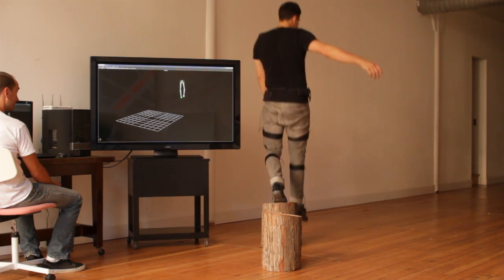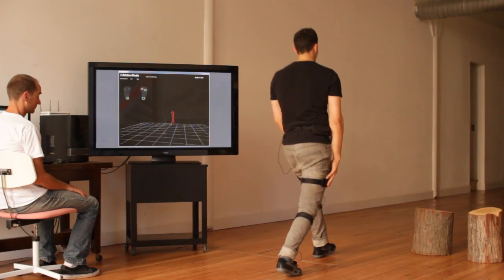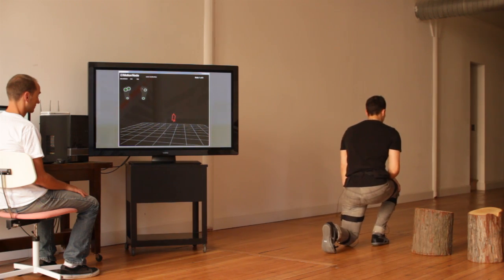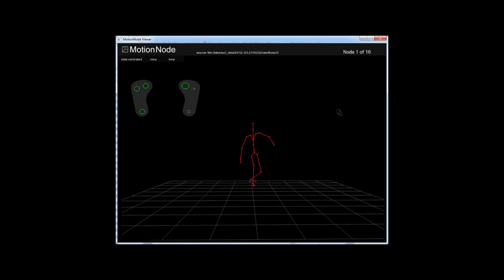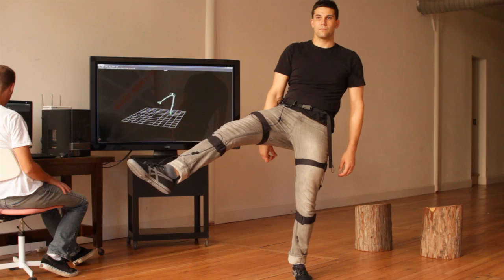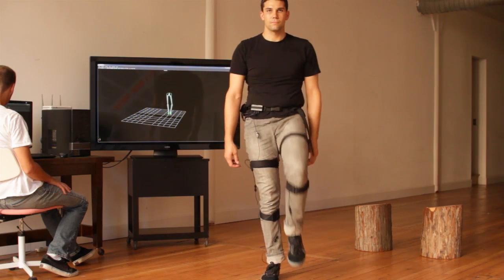The Shadow system includes an easy to use software user interface and a 3D viewer application for visualization of skeleton, orientation and position data from the inertial and pressure sensors. A software development kit is also included to access real-time sensor data in custom user applications.